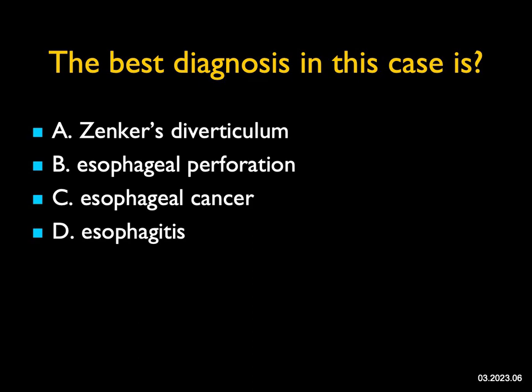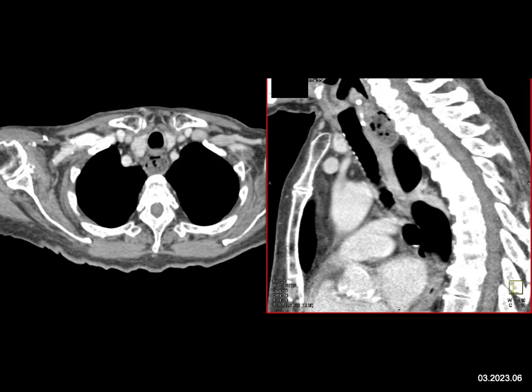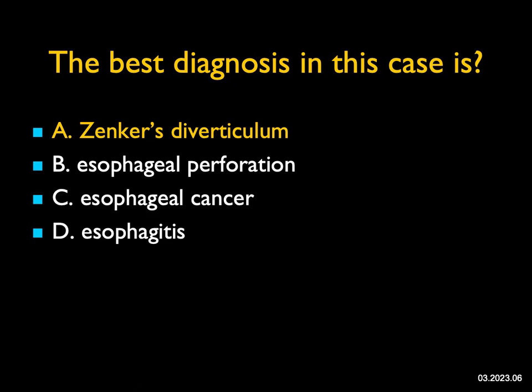The best diagnosis in this case — on axial images it looks like the esophagus is dilated with some food matter, but on the sagittal view you realize it's an outpouching from the esophagus in the upper third with food or fluid matter present. There's no free air, so not a perforation. Esophageal cancer or severe esophagitis are theoretical possibilities. But looking at all the images, this is an outpouching — perfect location, perfect appearance for a Zenker's diverticulum. A really nice example.